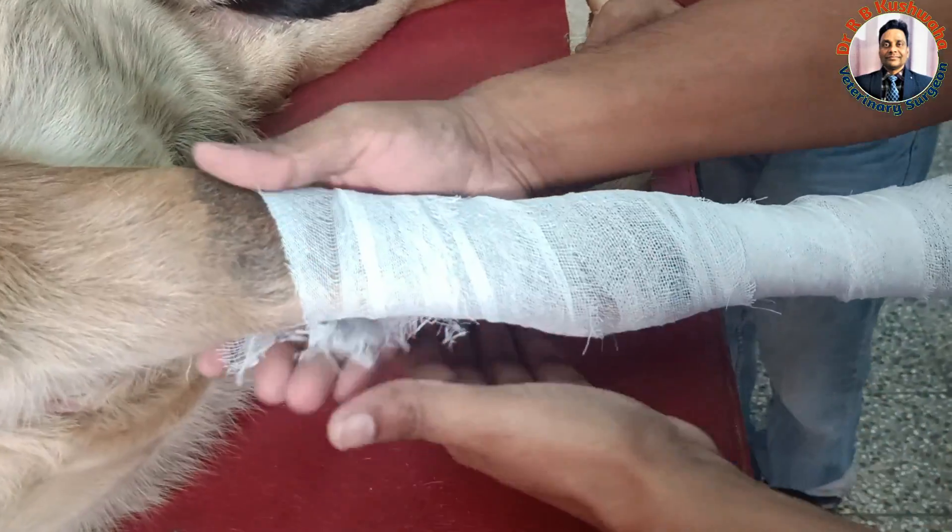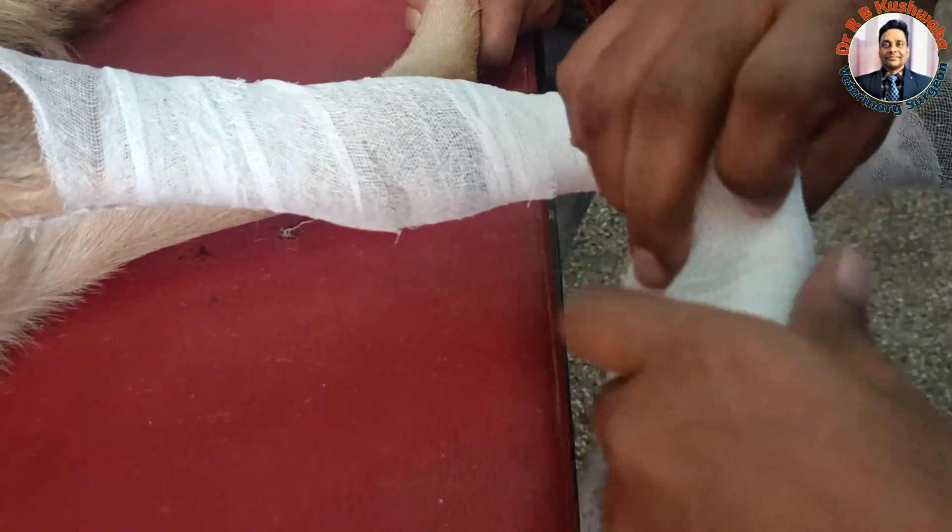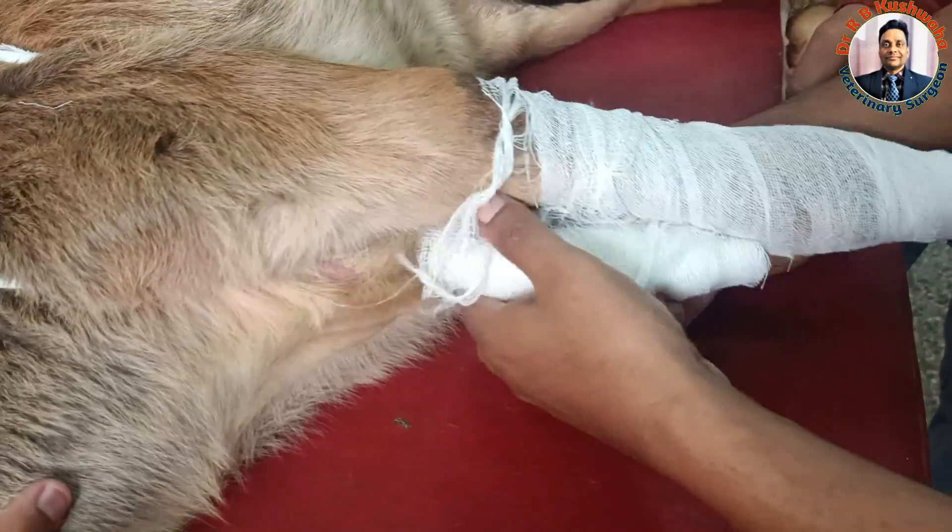Books recommend using a stockinette, but since we don't have one available, this bandage will act as a stockinette.